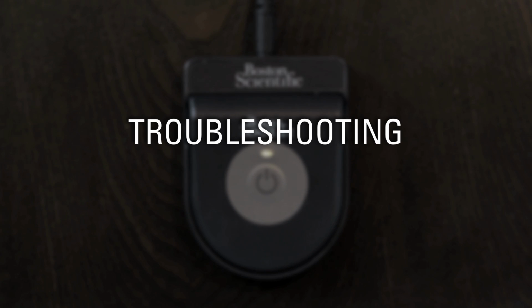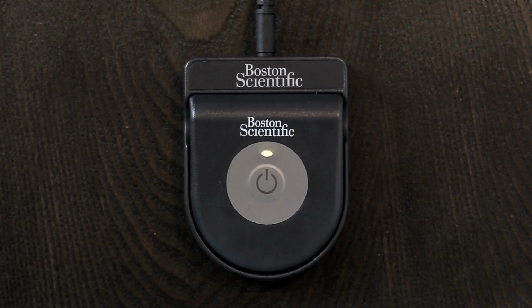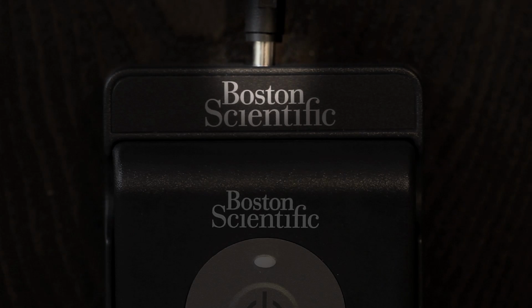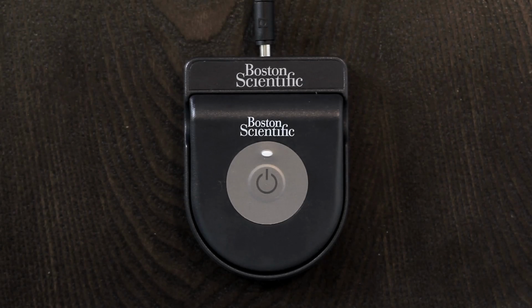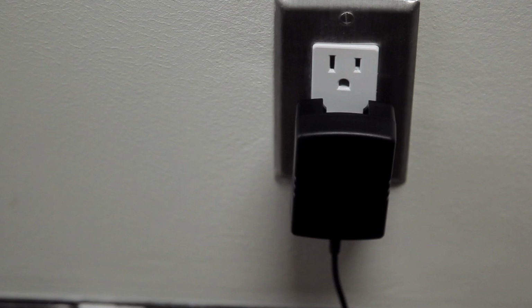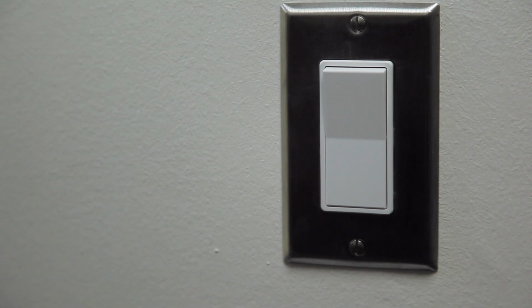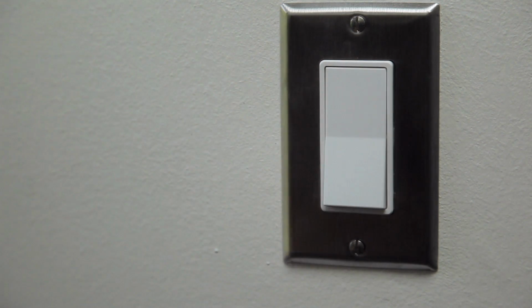Troubleshooting. If the charger's indicator light goes off when the charger is in the base station, or the light does not go on when you place it on the base station, the problem may be a loose connection. Make sure that the charger is correctly seated in the base station and that the connections are tight. You may also want to check whether the wall outlet or your surge protector has been turned off.